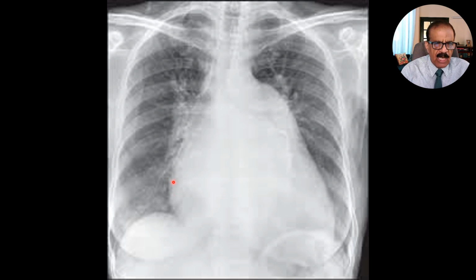They cause this enlargement of the cardiac border. This is typically described as mitralization because it is typically seen in mitral valve disease, but actually it may be seen in other conditions also. In pulmonary hypertension, for example, in atrial septal defect, in ventricular septal defect, the morphology is not very different.